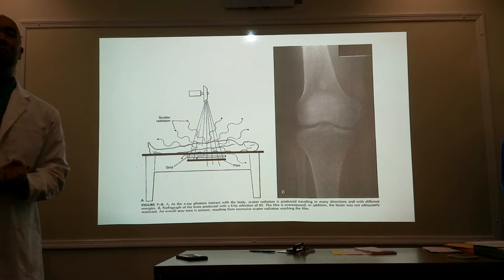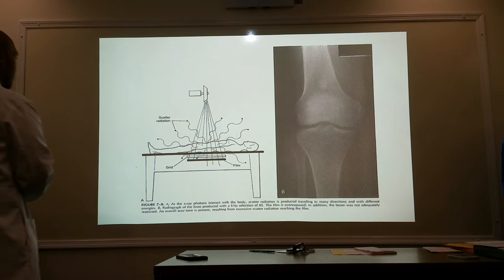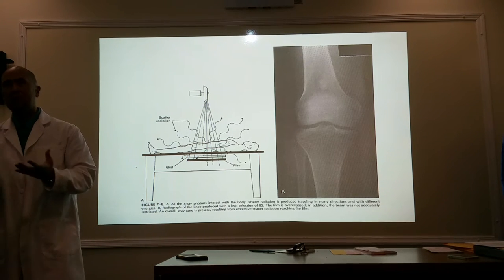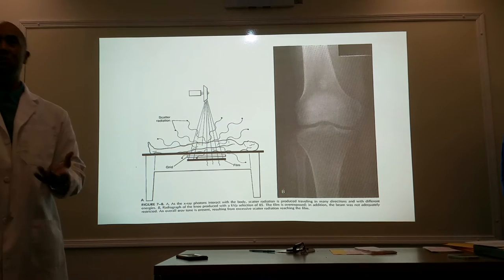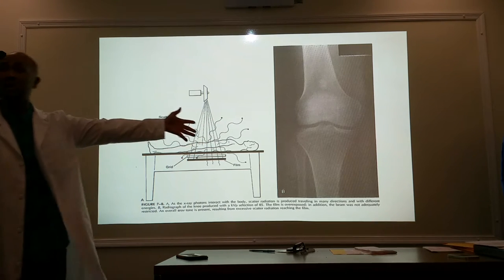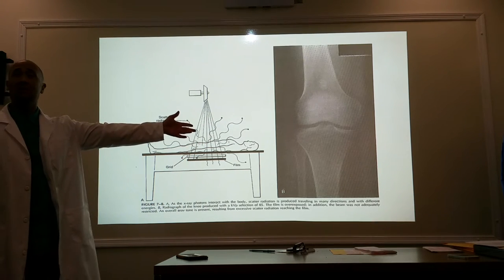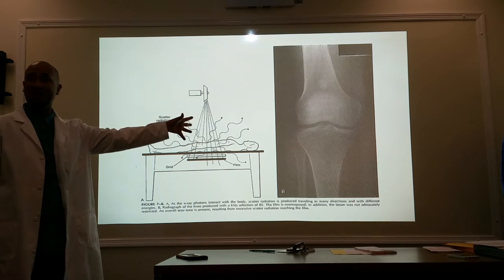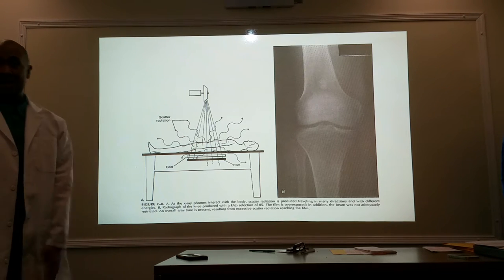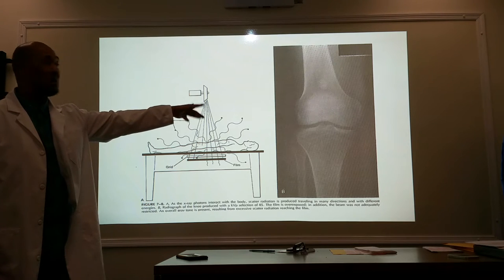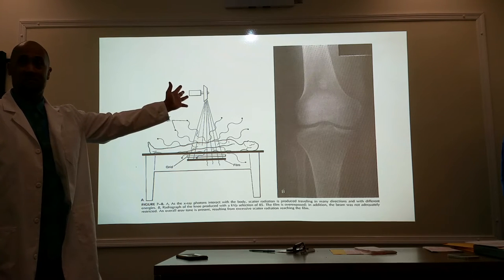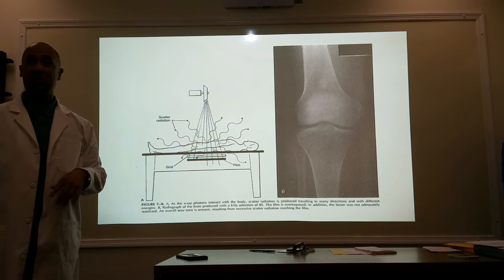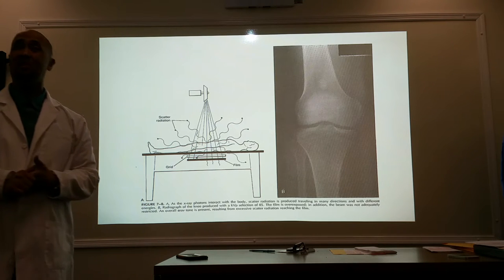Here's an example of a knee x-ray. It's a bone, right? What color is bone supposed to be? White. It's supposed to be white. But it looks gray — this is what's caused by unwanted density from scattered radiation. It should be nice black and white, but it's very gray. That's what scattered radiation does: it causes unwanted densities, or fog.